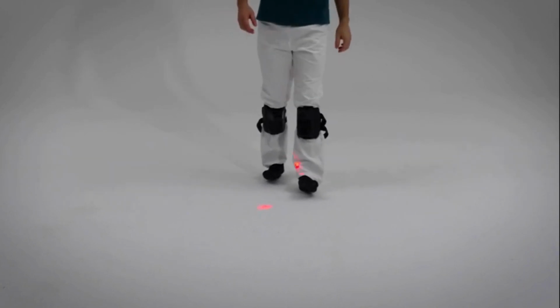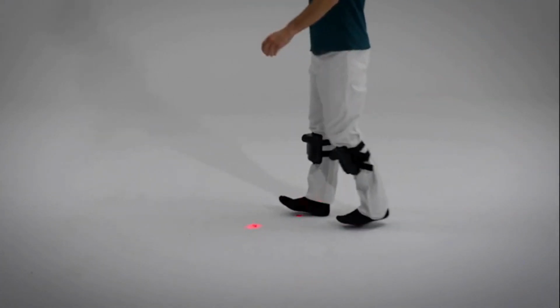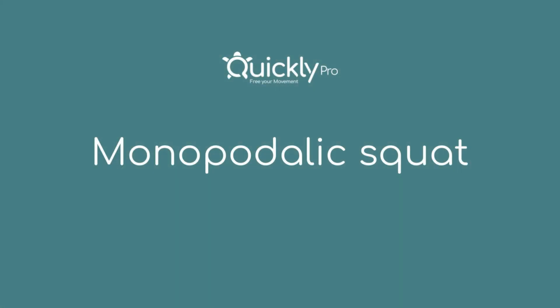Visual feedback helps to maintain attention and provide the ideal foothold by acting on the postural and balance system. By reducing the speed of execution, the monopedalic time is amplified, working on dynamic balance.